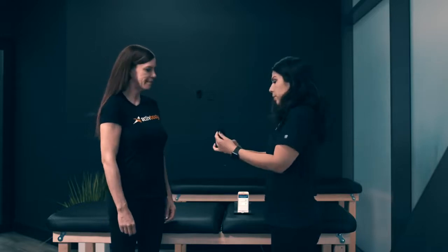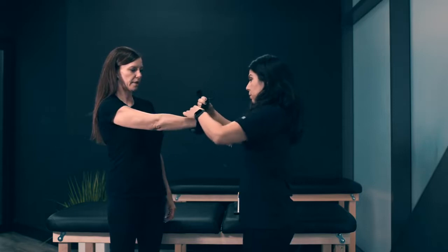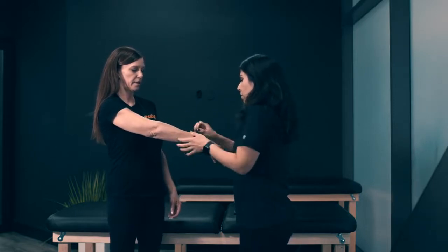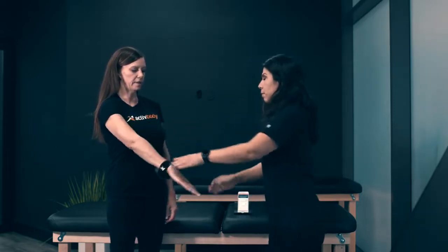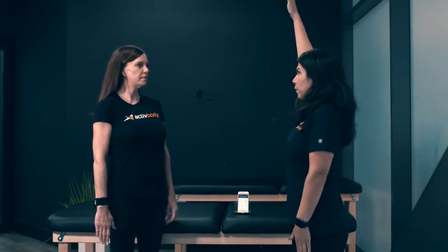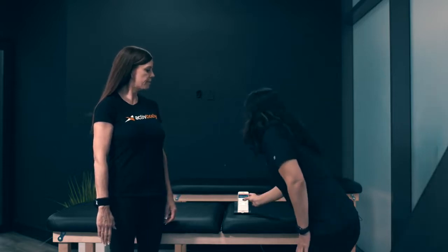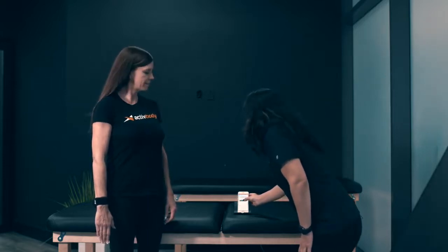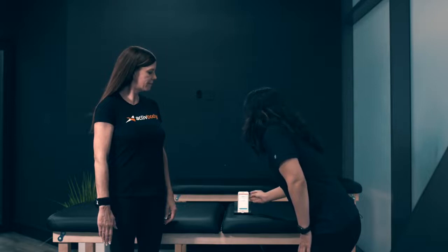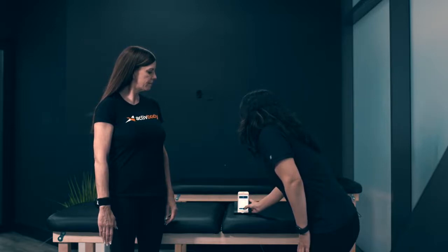With range of motion, I'm able to strap on the ActiveForce 2 device on the patient. We're going to start with flexion of the arm. With flexion, we're just going to go all the way up to the level of pain or discomfort. I want you to stop when you have pain. So we're going to do range of motion on the right arm, and this is going to be flexion. I'm going to press start.